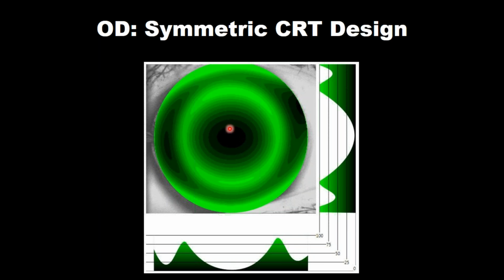And then maybe as importantly, what are we going to have for fluid across the steepest meridian? In this case, we can see a lens that has greater than 50 microns at this point and greater than 50 microns at this point. This is where we want the lens to land itself down, and it's hanging in air by about 50 microns, or hanging in fluid by 50 microns.